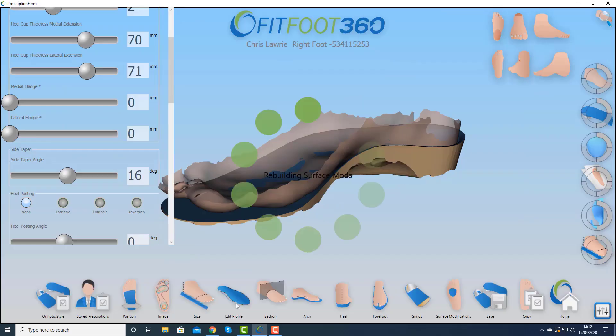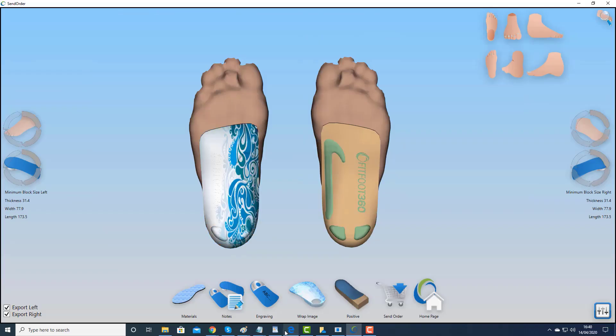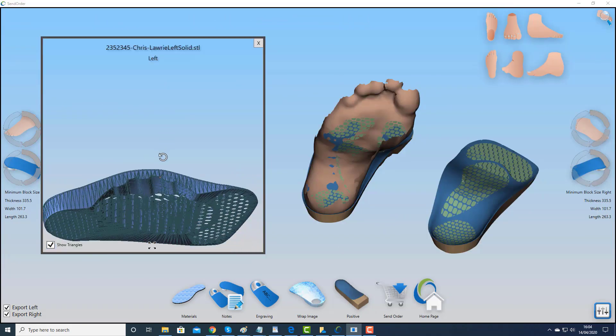Back in version 2.1 we added features for designing and manufacturing TPU devices, we added colour, and also the ability to be able to view the outcome of a design on the screen.